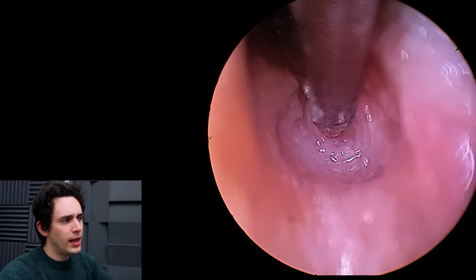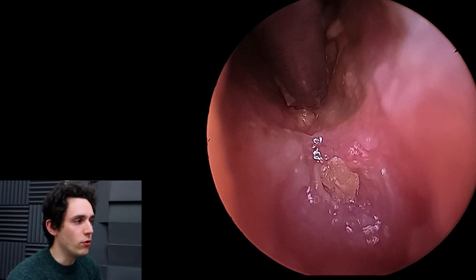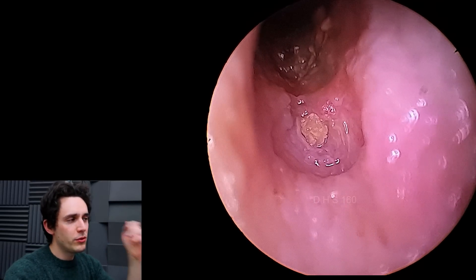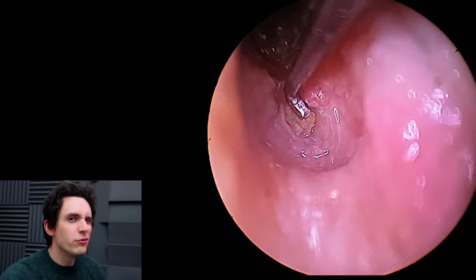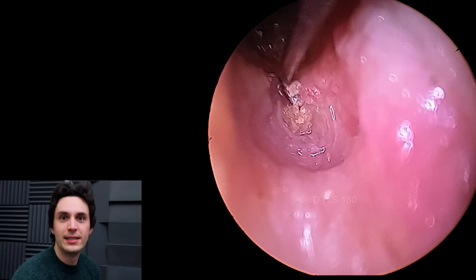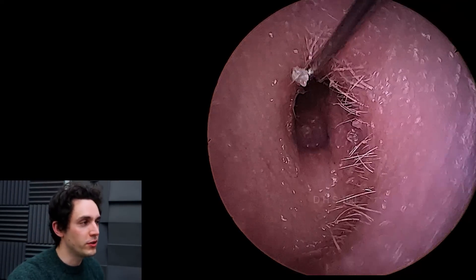What we see here is a nice little trench or depression in the ear canal, and that little yellow nugget there is a piece of sequestra — basically a piece of bone. I've got the metal hook and I'm having a feel of it. I didn't intend to take a sample here, but we will put this sample underneath the microscope at the end so I can prove to you it's sequestra.